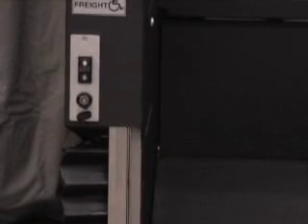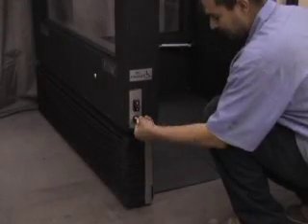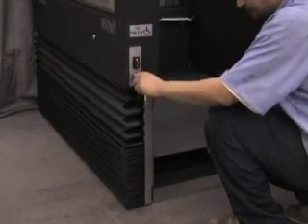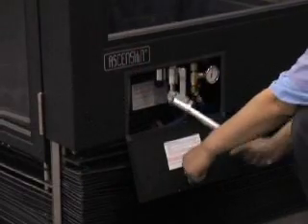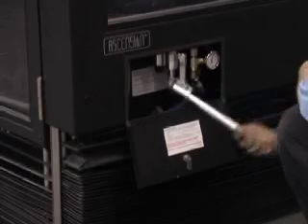Hold an operating switch up while turning the override key clockwise, located at the lower landing operation station, to raise the lift car until it stops automatically. The lift car will rise approximately 9 to 10 inches. If you are using the hand pump, stop pumping when the lift car floor is 9 to 10 inches off of the ground. It is not necessary to turn the override key while using the hand pump.